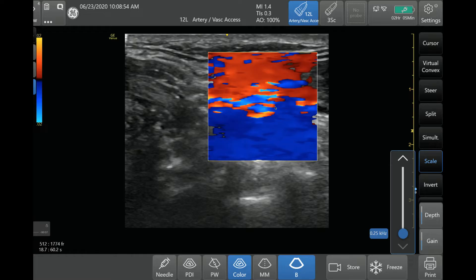If you bring this scale down — which I'm going to do here — now it goes to 2 centimeters per second. You can see there's a lot of what we call aliasing, because it's detecting such low flows that it is essentially looping around between reds and blues. This is obviously a scale that's way too low for this type of application, so I just wanted to show you what that looked like.